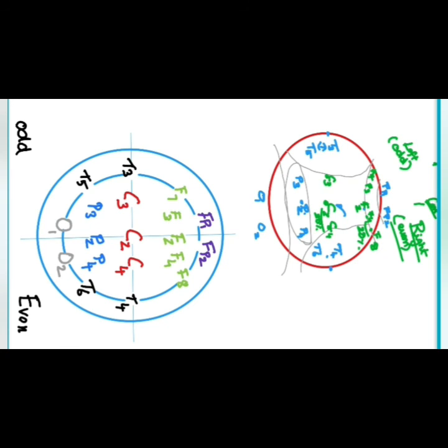So this is how the electrodes are correctly placed, and in addition to that there are also electrodes like A1 and A2, right? So these are auditory electrodes, A1 and A2, that are on the sides over your ear, right? So try to understand how the electrodes are placed. Once you understand it, you can easily draw the diagram, right? Thank you.